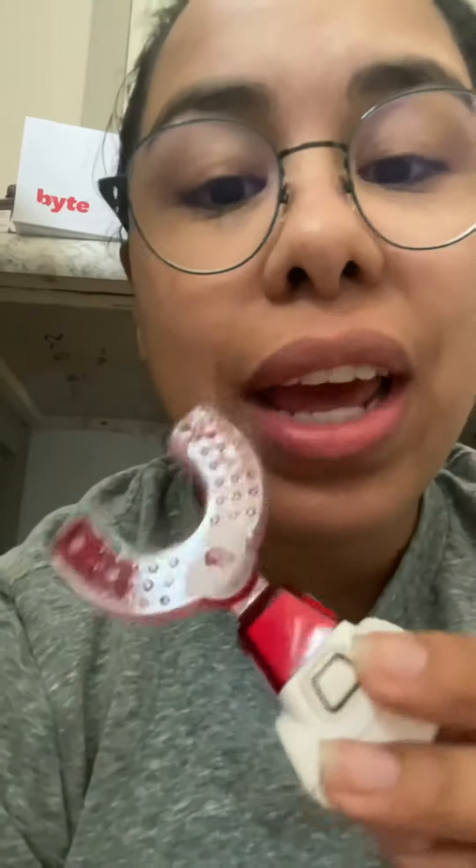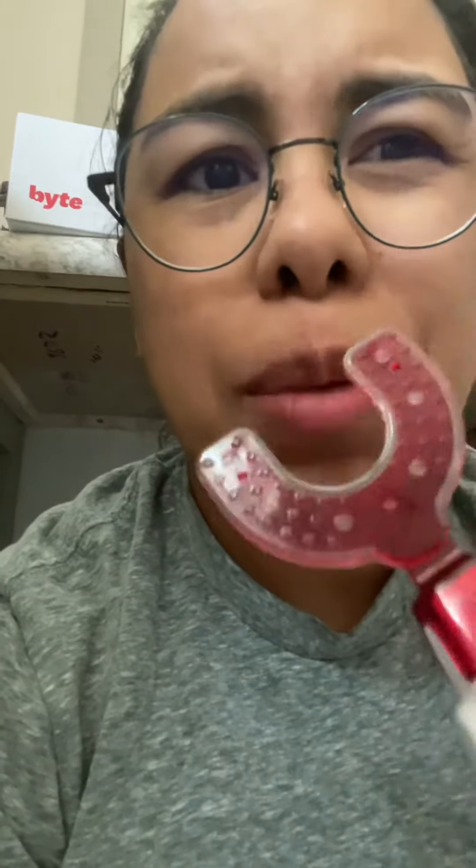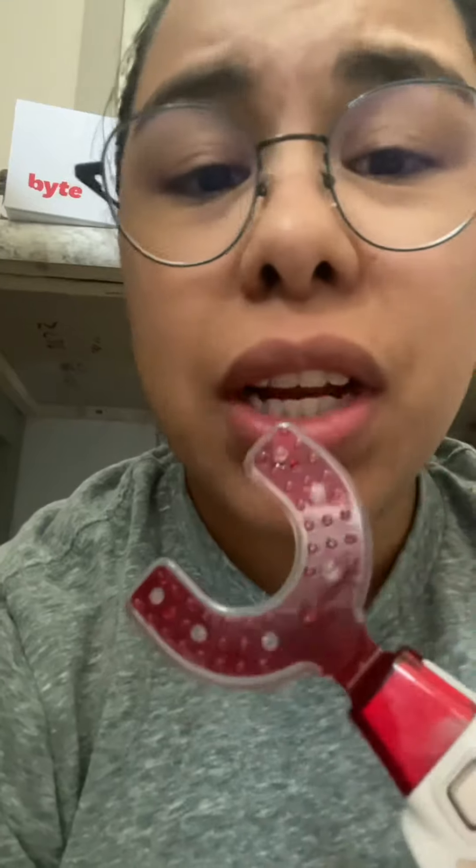Night one — pretty rough, pretty sore. My top ones are more sore than my bottom. I have this weird lisp. I didn't charge my HyperBite before I put them in, so I had to charge it overnight. I'm gonna put it in now and see if it helps relieve some of the discomfort. This is pretty uncomfortable, but the HyperBite definitely helps a lot.